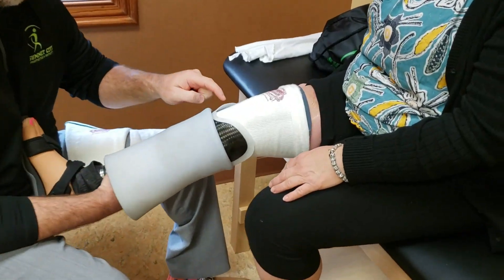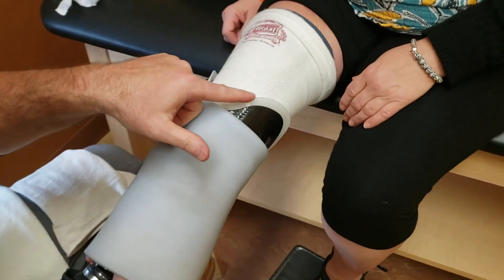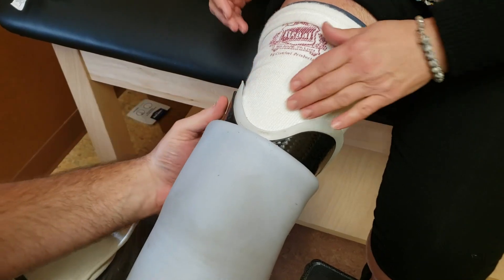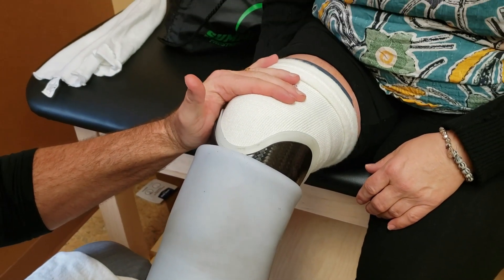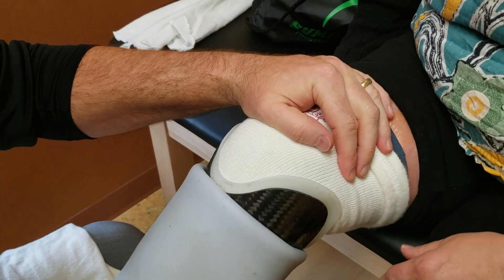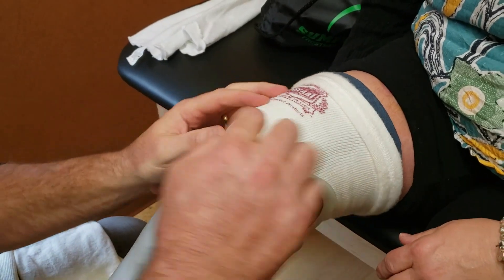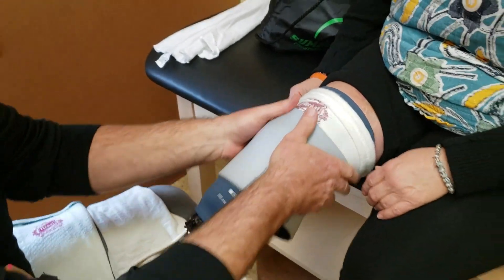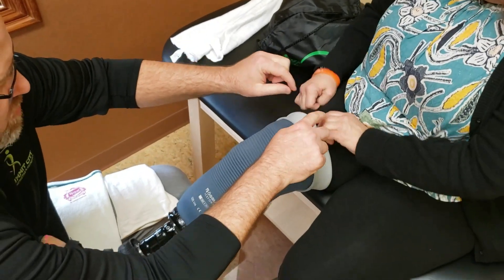As we discussed through the test sockets, there's a little horseshoe shape — we want that right underneath the kneecap. We'll bend the knee just a little bit as we start to work our way into it. The three-ply is a very good level of tension, allowing you to slowly make your way into the socket. Once the kneecap is very close to the horseshoe, that's when you're going to roll the sleeve up with the knee as straight as possible.